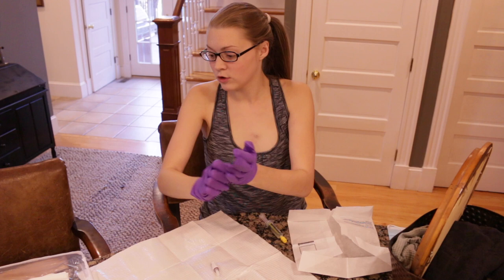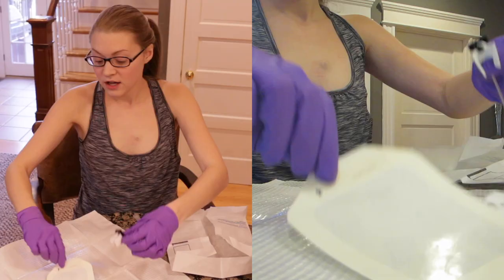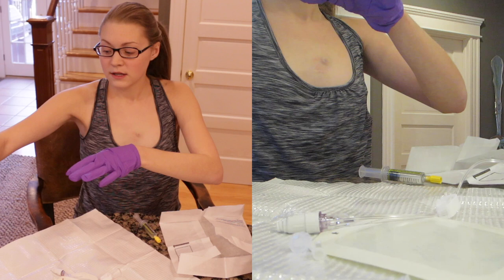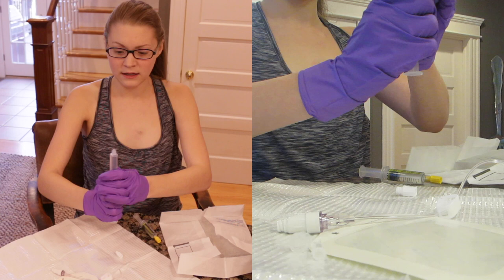Once you've got your gloves on, go ahead and hook up the needle to the cap, or the extension if you've decided to do that. Now that I'm sterile I'm okay to touch anything on this field. Take off the little plastic extras, screw it on nice and tight, and you've got your needle and cap hooked up. I'm going to grab a saline out of the sterile dressing change kit — the whole thing is sterile so I'm free to use it. I've just primed it so that there are no more bubbles, and you want to prime your tubing and your needle.